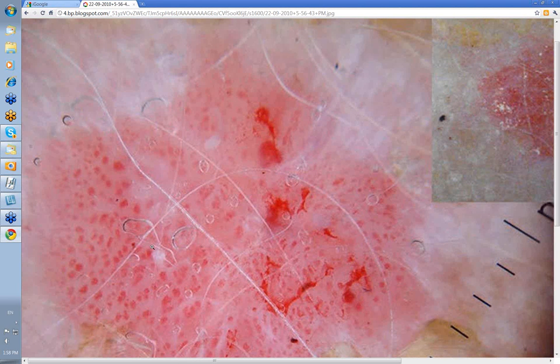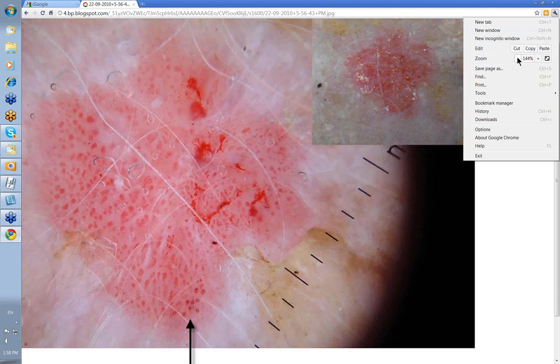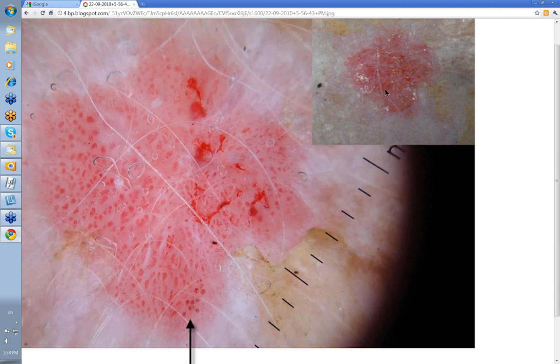These are the coiled vessels of an SCC in situ. There's the clinical there, and these are the coiled vessels of an SCC in situ or Bowen's disease.